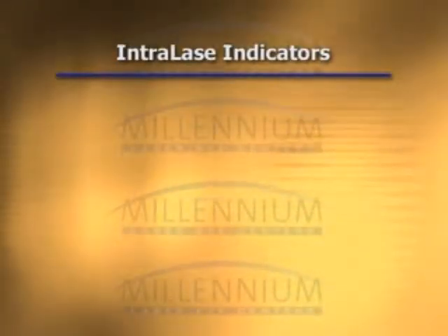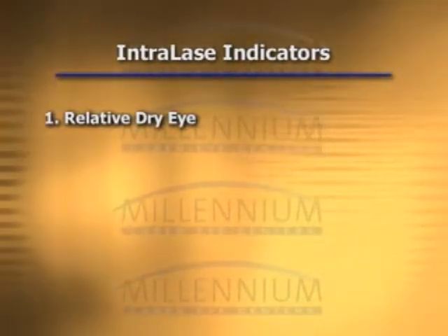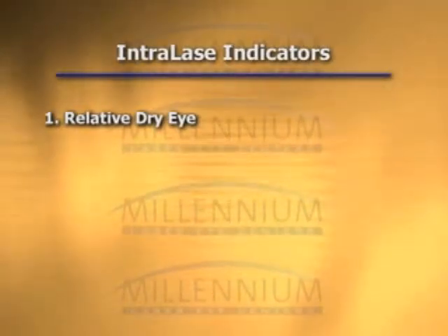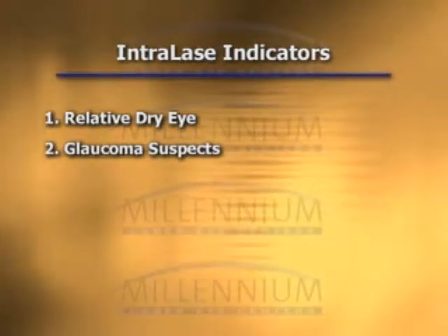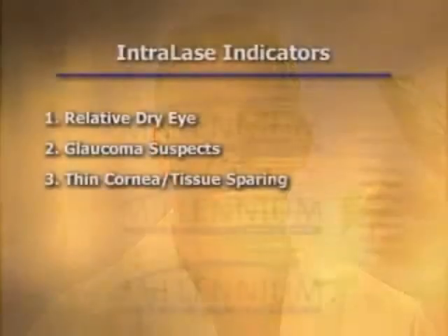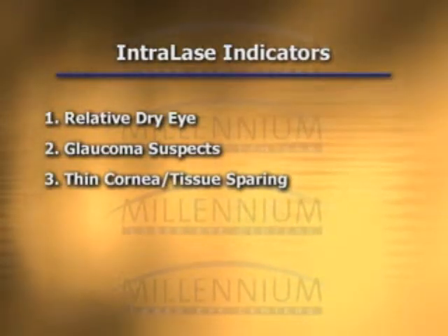There are some situations in which Intralase is clearly beneficial to patients looking into LASIK. In those who have been diagnosed with dry eye, Intralase spares some of the sensory nerves in the cornea responsible for reflex tearing than the manual keratome. Intralase also places less pressure on your eye than the microkeratome. Aside from comfort considerations, this creates greater safety for patients who are glaucoma suspects. Intralase can also allow some of those who were not previously considered candidates due to thinner corneas the ability to have the procedure. This is because Intralase is more accurate and hence flaps can be made thinner.